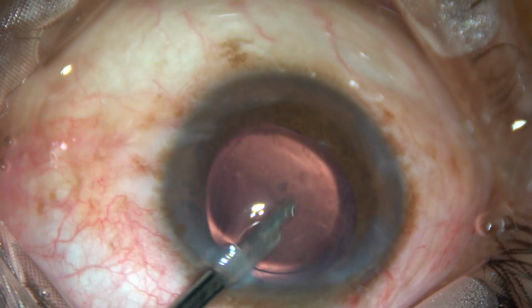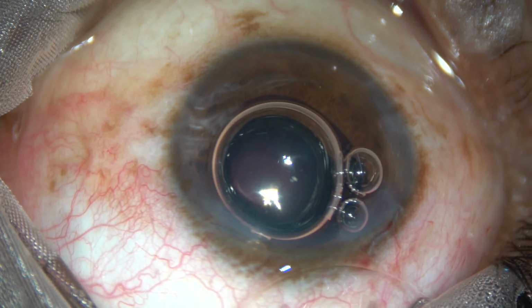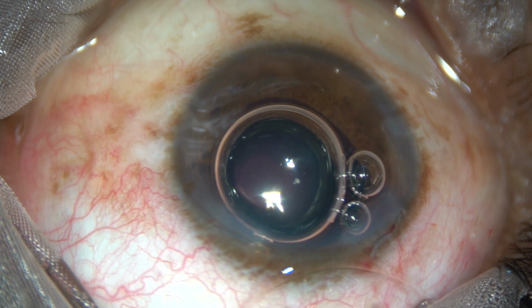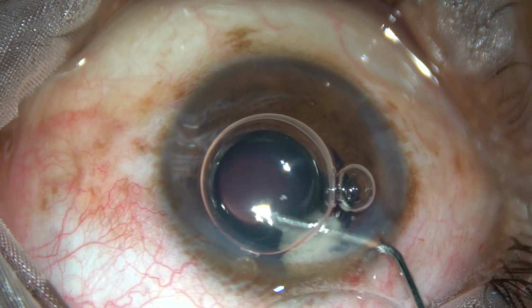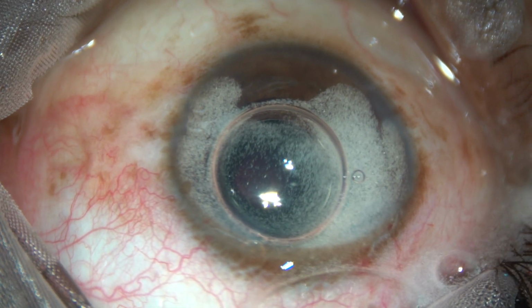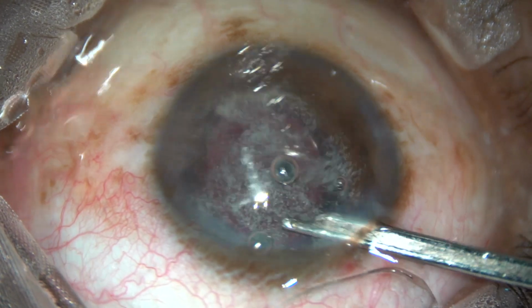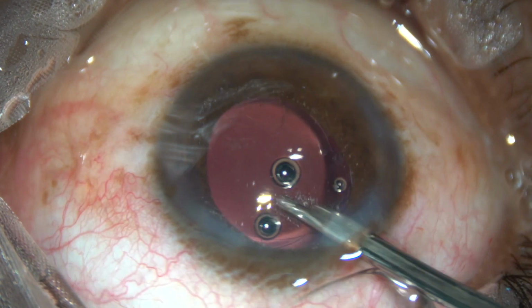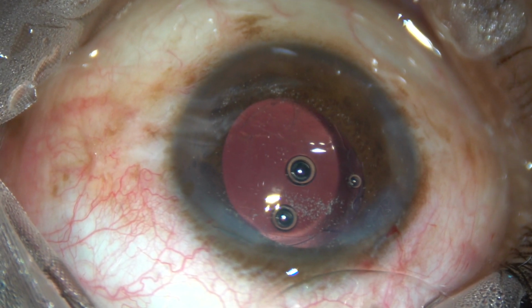So I have asked for my vitrectomy machine. It is Accurus from Alcon. And now I have asked for triamcinolone acetate. I inject the triamcinolone in the anterior chamber. Use the Simcoe cannula to remove the triamcinolone, and I can find that the vitreous strands are only lower down at 5 o'clock and 6 o'clock.